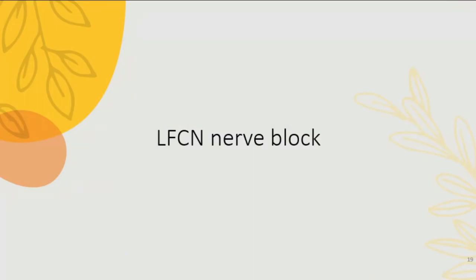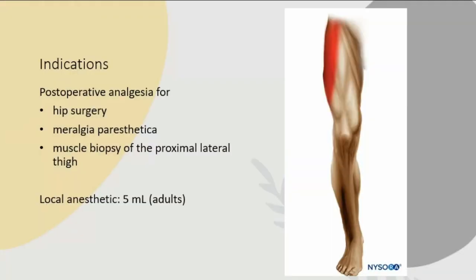So LFCN, we are going to the LFCN nerve block. To me personally, this is one of the very difficult nerves to identify, because sometimes I can see it, sometimes I don't. After I read a bit for the presentation, only then did I know there's a trick to it. So later I'll show you guys what the trick is.